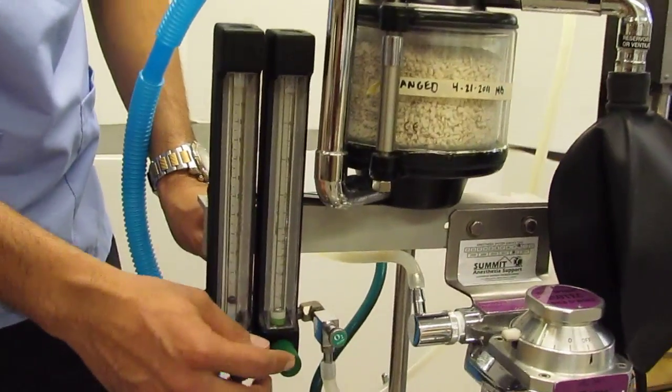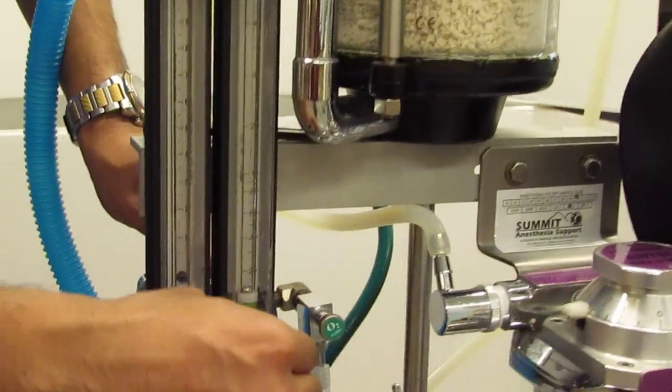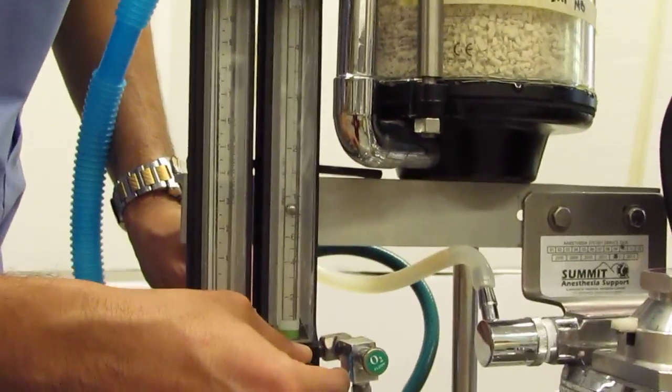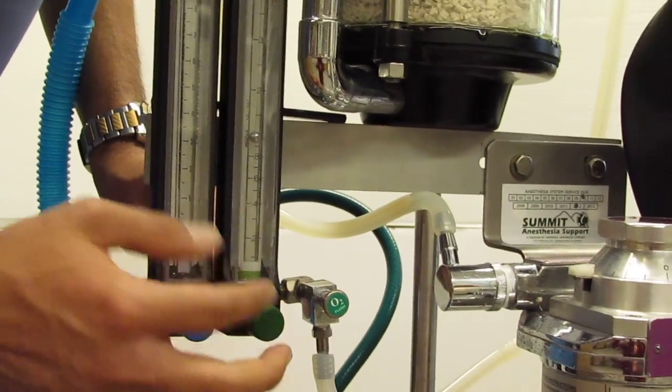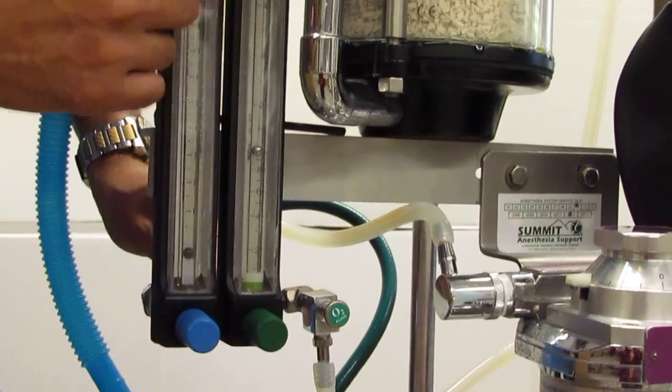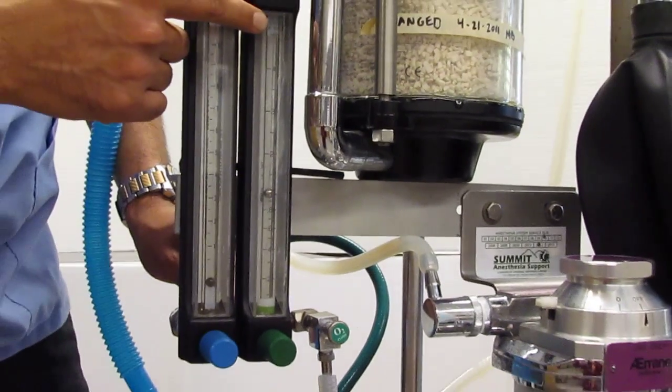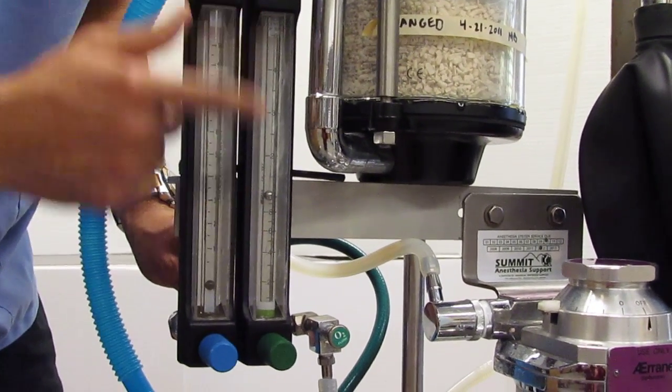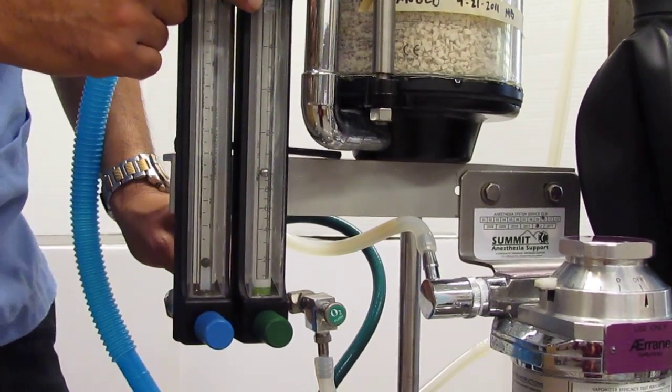A couple things can happen at our flow meter. One, we can set the flow of oxygen to our vaporizer in this flow meter anywhere from zero to about four and a half, okay? This one is set to about zero to four and a half liters per minute.